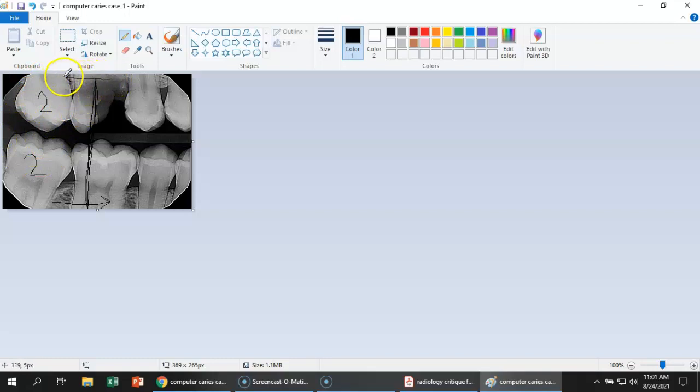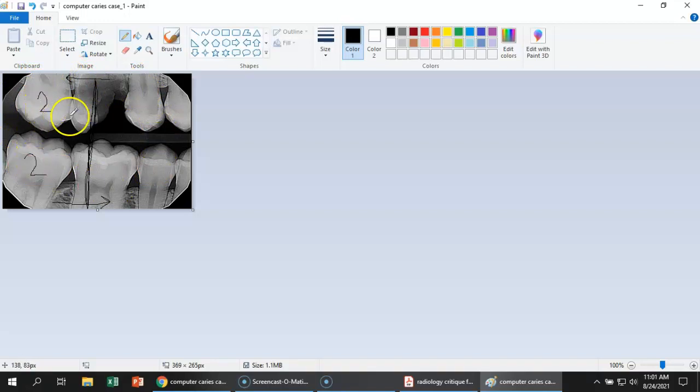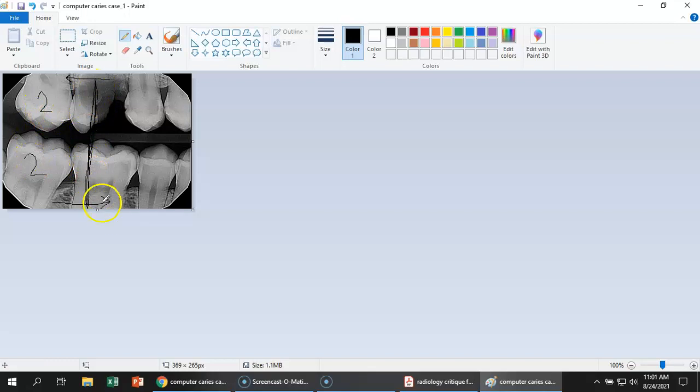So the sensor actually needs to be placed more posteriorly so that the whole sensor moves back this way, therefore moving the second molars into the center position over the sensor.